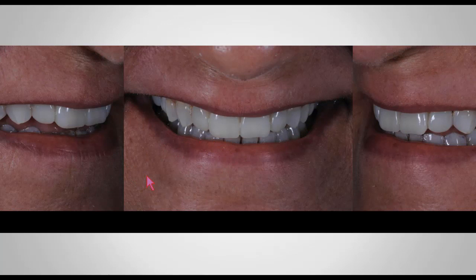I show my patients right at that moment the before and after photo, how she got to my chair when I was making all the impressions and the photos, and then how she's leaving my chair today after I delivered that prototype. You can see this is a full smile of the patient. She's extremely happy. You can see that she hasn't been numb, but most importantly, she's already telling me how much she likes her new teeth and how much she likes my plan.